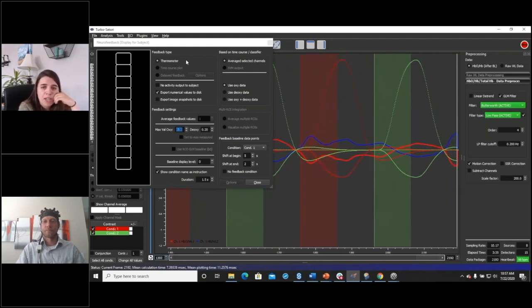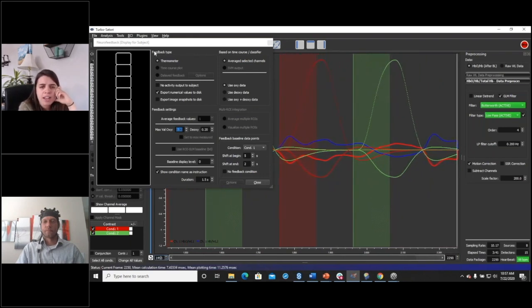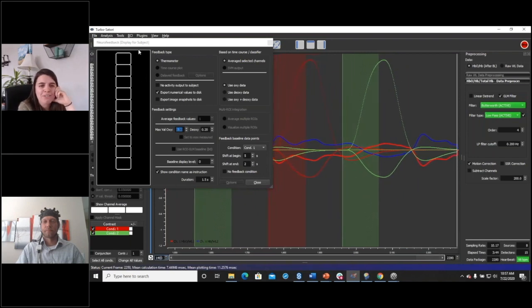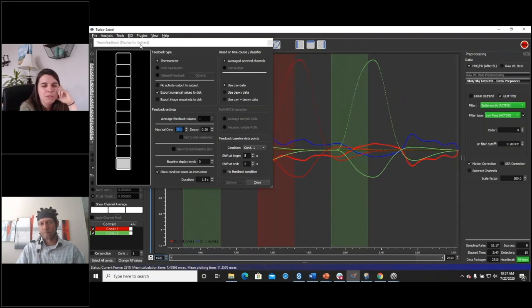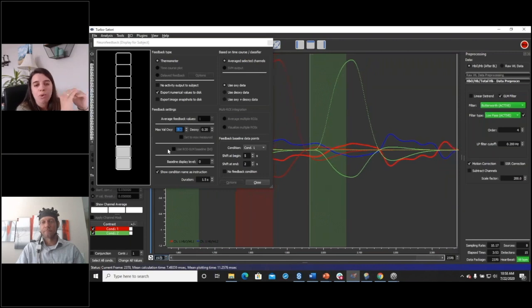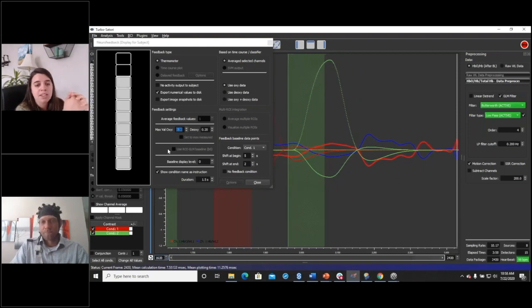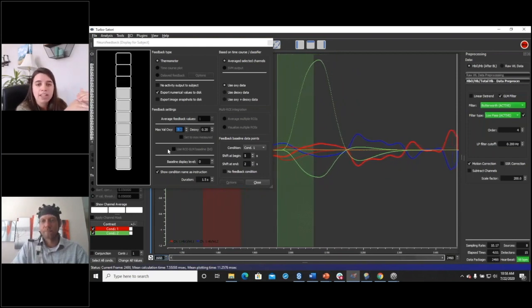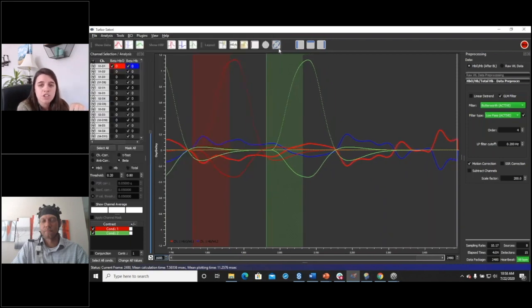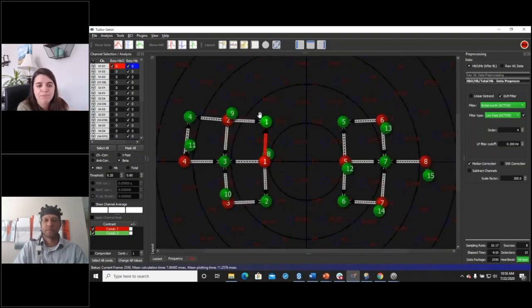There we have the neurofeedback from Eric's finger tapping task. We could certainly optimize this a bit better for Eric. I think maybe some webinar day jitters are leading to a little reduced concentration for this response. It was a bit stronger when we practiced it. But nonetheless, the trend is there, and we understand the output, right? We ran this task looking for the oxy beta value, and we expected it to be greater for the right-hand condition as compared to the left-hand condition, since this channel is over the left motor cortex. And that is all. That is this preview, this analysis pipeline that we're showing you in Satori.